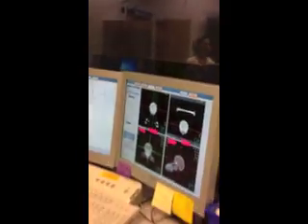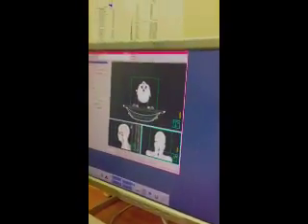The next step will be creating the radiation treatment plan, which we will do in the Symmetry. This is a process that we will go through once the patient has been simulated to create their whole brain irradiation treatment plan. First thing, which we have already done, is import the data set into the treatment planning system.